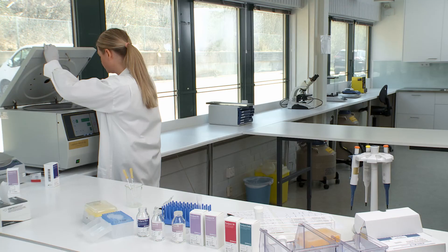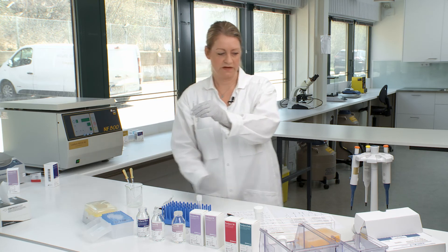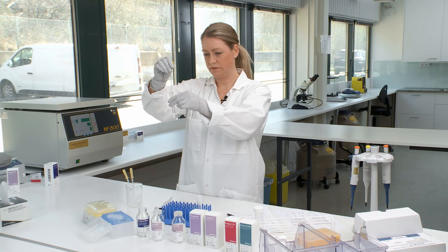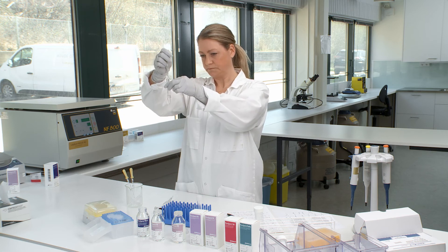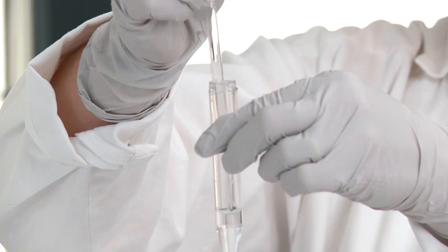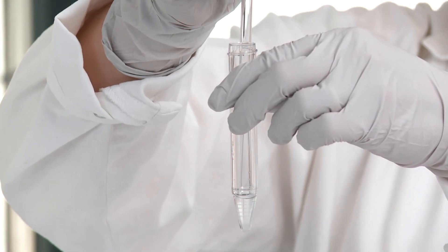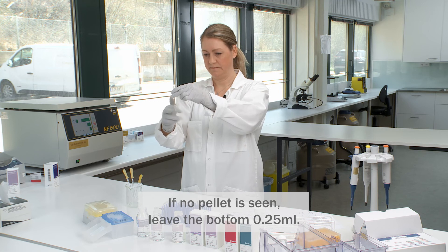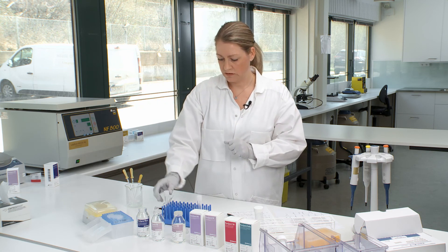Once the second centrifugation step is finished, take out the tube from the centrifuge and remove the supernatant again. Depending on what the sample should be used for, leave the appropriate volume of washing medium plus the pellet, then re-suspend the pellet in the medium. Now you can leave the sample at room temperature until it's being used.